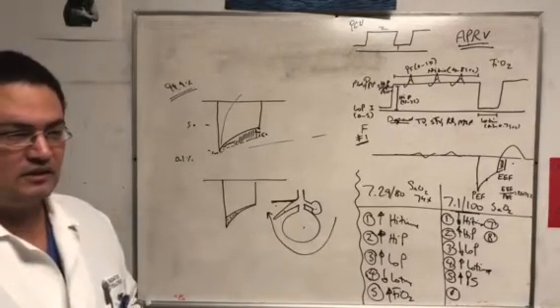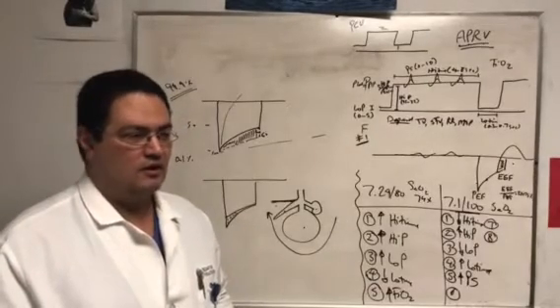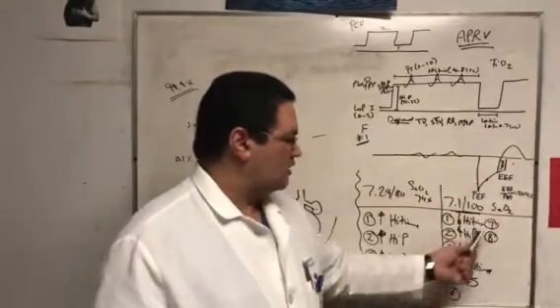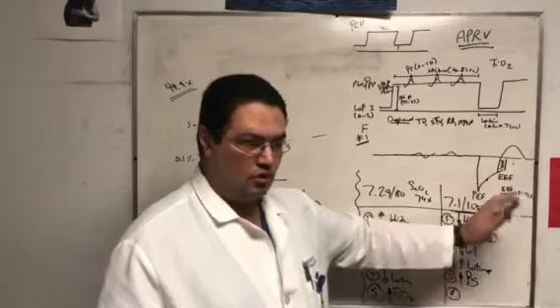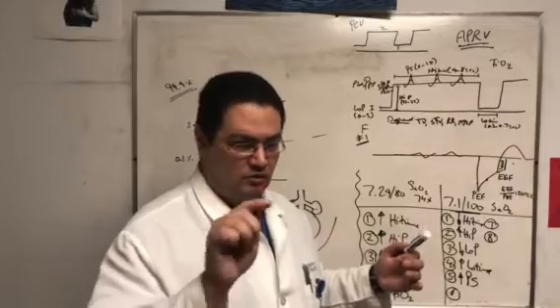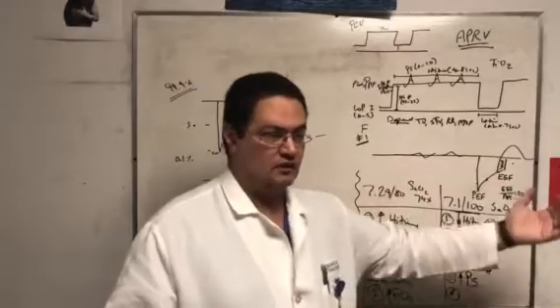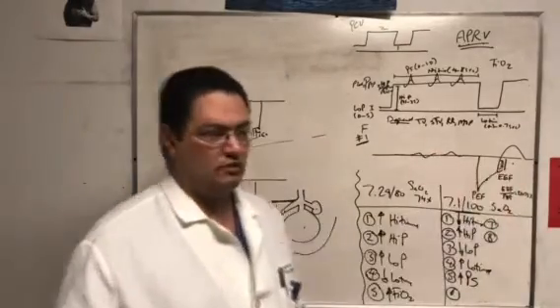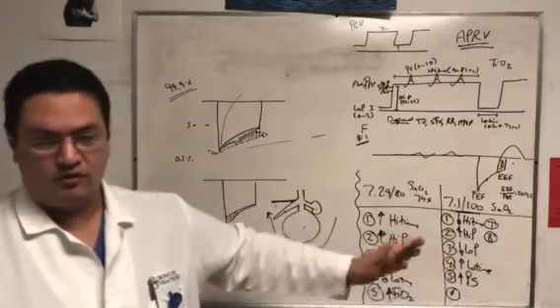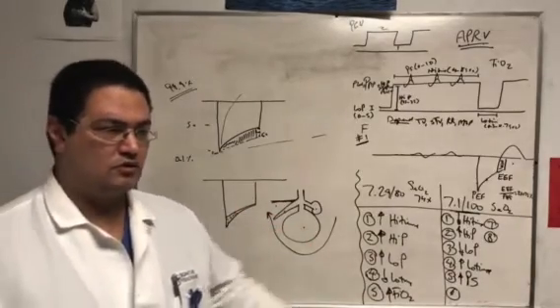The only problem with that is that it's almost like throwing in the towel early, throwing your white towel early, because when I say increase the low time, you will never come out of this ratio. You're always going to remain within the ratio. That goes without saying. The ratio was 60%, I'll make it 30%. That's more area under the curve. But even though you're still within the ratio, the higher the ratio, the better the recruitment. The lower the ratio, the less the recruitment.